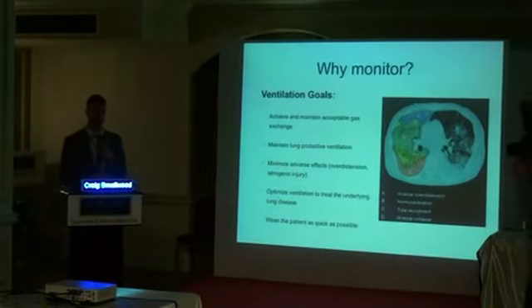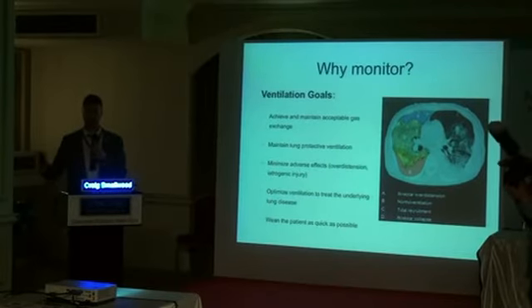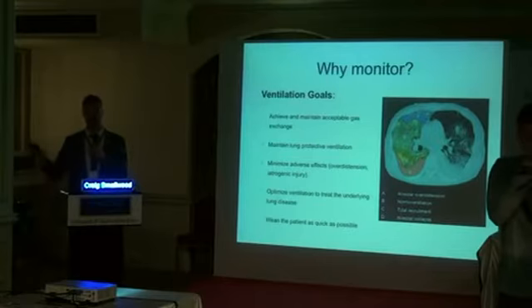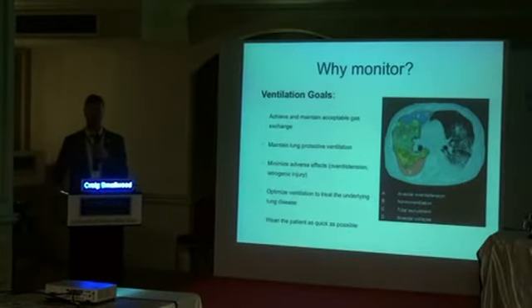So historically, what we've done is apply all these targets of ventilation. So ARDS-net ventilation is probably one of the most famous. So small tidal volumes, a little bit higher PEEP, and trying to minimize peak airway pressure or applied airway pressure. And that has worked across the population fairly well.